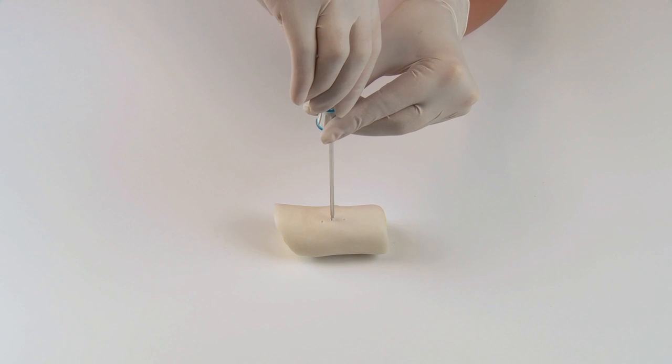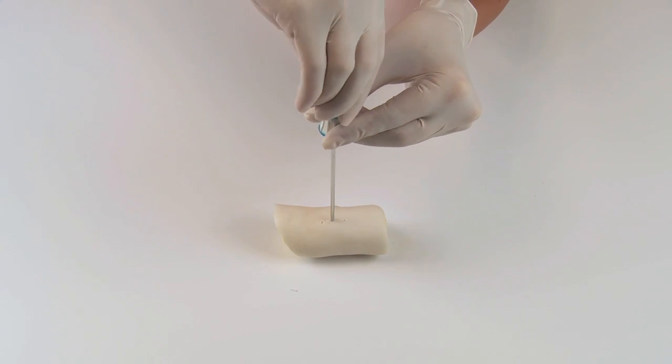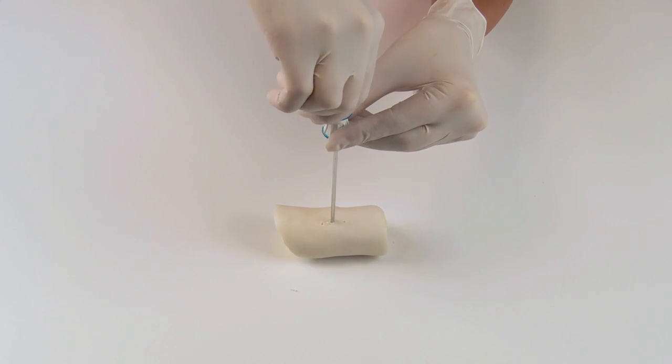Now continue to drill to the cortical bone. Use moderate axial pressure and as long turns as possible.